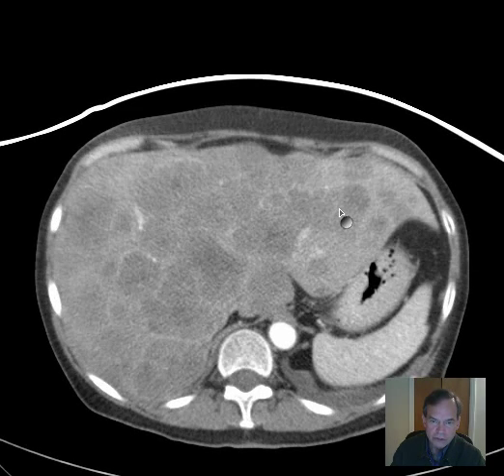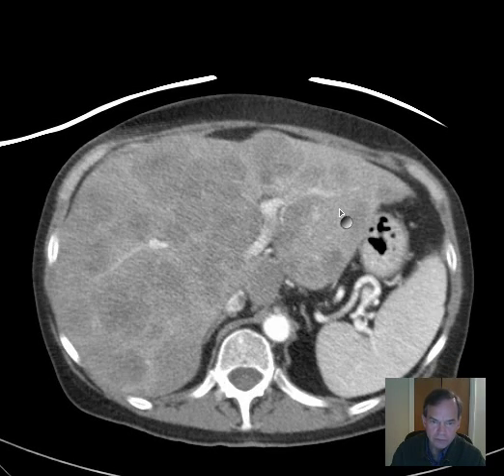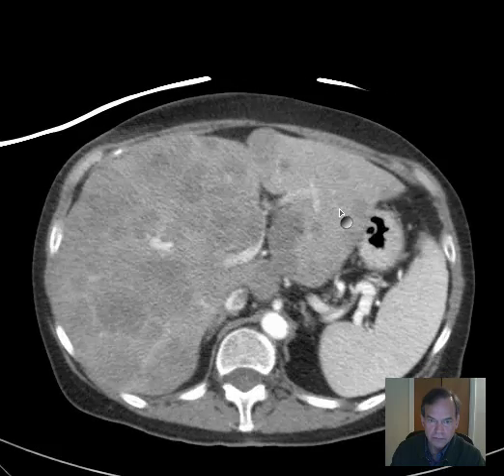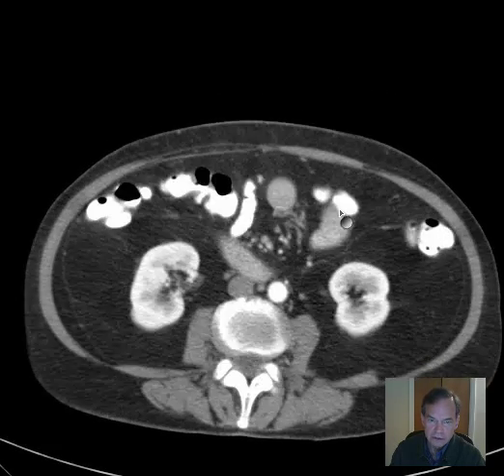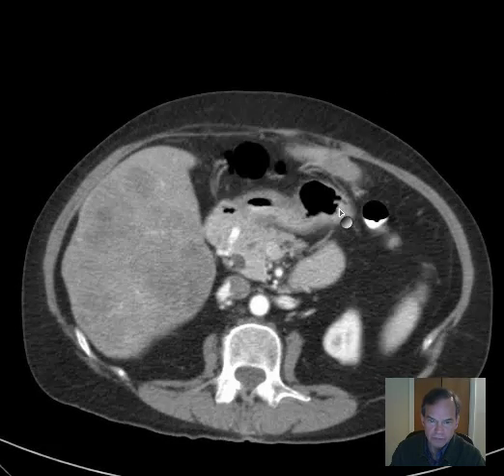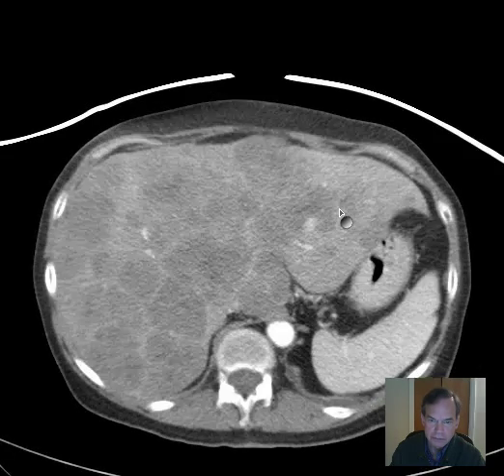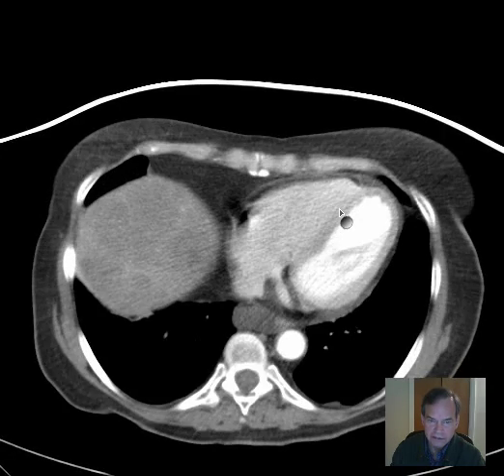We see this often with colon cancer. Colon cancer will commonly have metastatic lesions to the liver, and they may look like this. Sometimes they're referred to as cannonball metastases — big, round things like this.